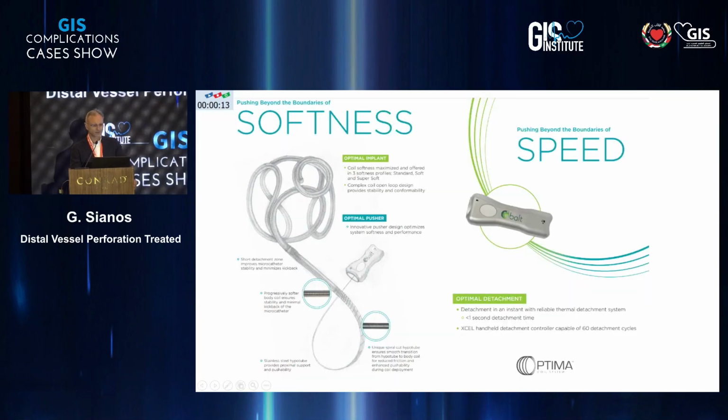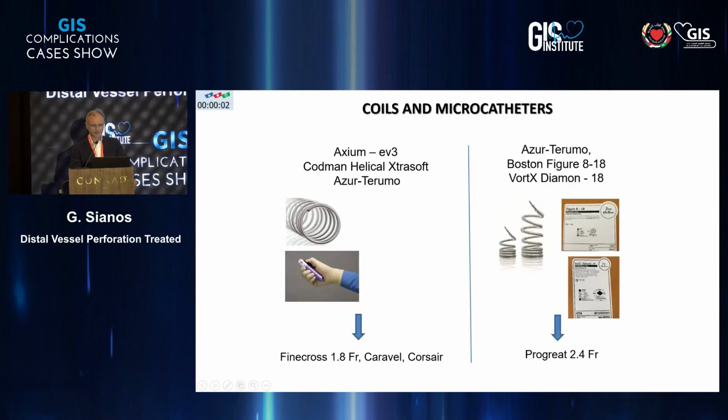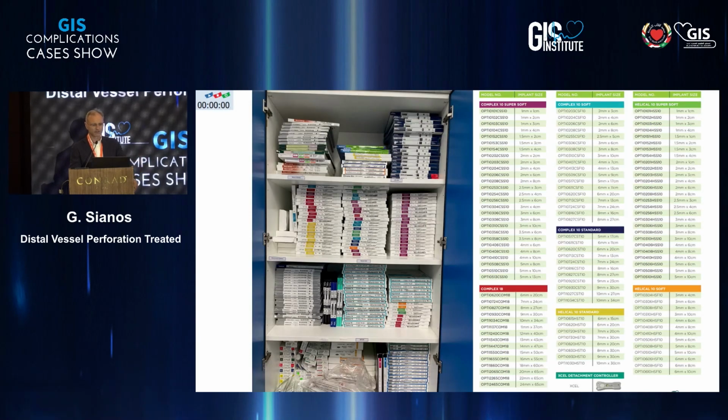That's this specific coil that I told you, and this is a device here to release it. This is it. One of the things that was discussed, you have to have the full portfolio. This is the release device. There are others that will be discussed, but the message that I want to close, you saw the picture and it's not necessary to stay longer. You have to have a lot of devices on that and you have to know them. And the cath lab, it was mentioned, has to be prepared. Excellent. Thank you.